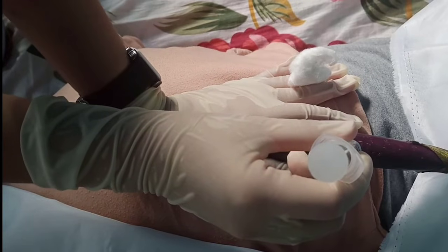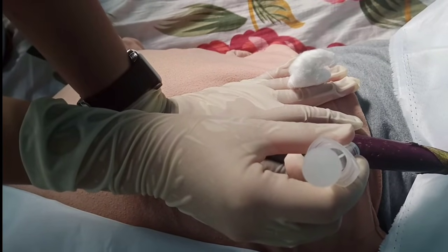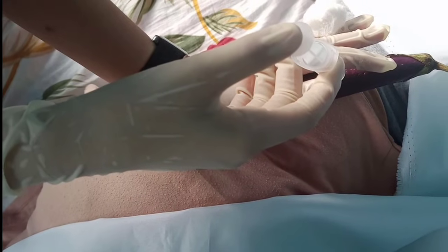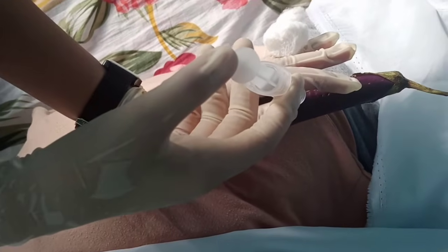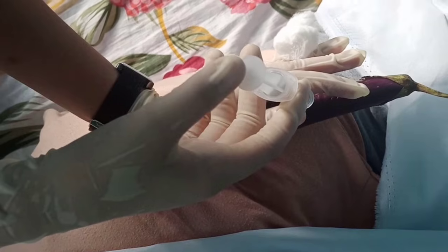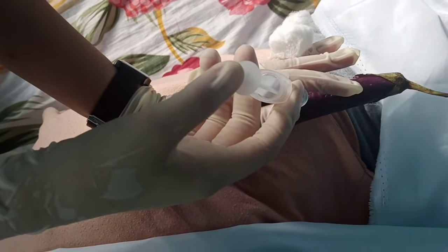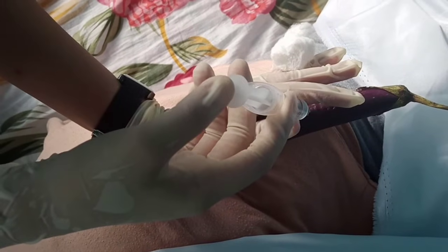Aspirate the syringe by pulling back the plunger with your dominant hand. This is to determine if you have hit a blood vessel. If blood appears, then it means that you have hit a blood vessel. And then remove and discard the needle and syringe and start over. Inject the medication slowly at the rate of 1 ml at 10 seconds and wait 10 seconds and smoothly withdraw the needle.